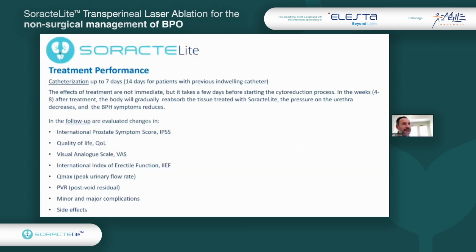So basically it comes after 4 up to 8 weeks after treatment. So this is the time that the body needs to gradually reabsorb the tissue treated with SoracteLite and to decrease the pressure of the adenoma on the urethra, and so to reduce the BPH related symptoms. So this is basically what we check in the follow-up. We check the IPSS score, quality of life. We see what is the pain of the patient after the procedure using a VAS scale.